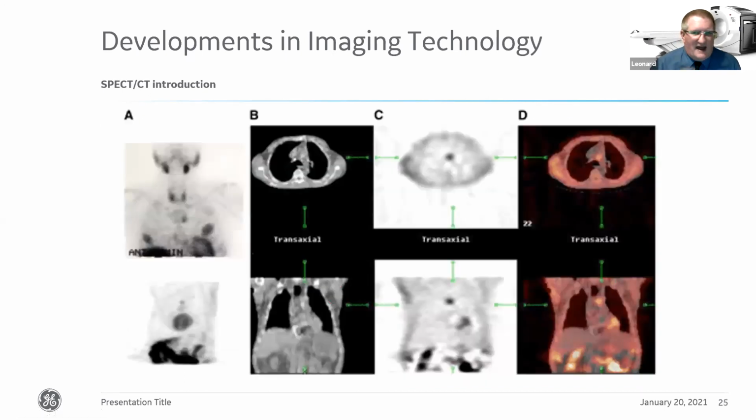The benefit of that is when we're coming to review on a lot of given areas. So this is a very quick example to show you that when we're doing the CT scans on these systems, they're very, very poor quality. But what it does mean is we've got true accuracy about what the uptake is within these lesions. Okay, so it was not going to cause any problems.